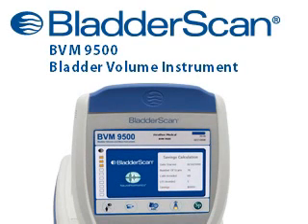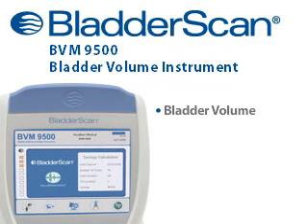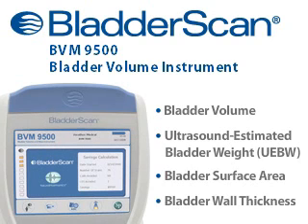Introducing the BladderScan BVM9500 Bladder Volume and Bladder Wall Mass Instrument. The BVM9500 uses non-invasive ultrasound to measure bladder volume and ultrasound-estimated bladder weight, UEBW, bladder surface area, and bladder wall thickness.